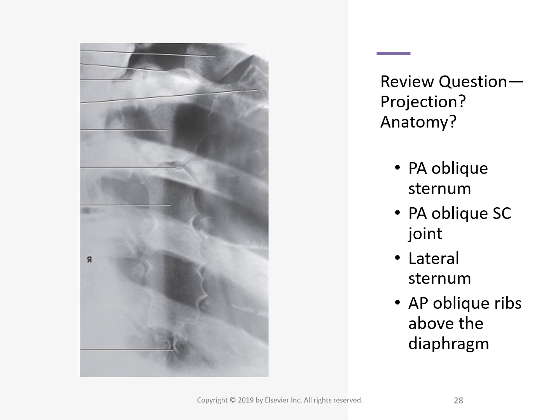And let me indicate, so you see all these anatomy lines? I'm going from the most superior, the top one, that is the clavicle. That's the proximal end of the clavicle coming in. And then the second line down is the jugular notch. Okay. The sternoclavicular joint looks like the patient's right sternoclavicular joint is the third line down. Okay. The first rib anterior cartilage on the left is the fourth line down. The manubrium is the fifth line down. The sternal angle appears at the sixth line from the top.